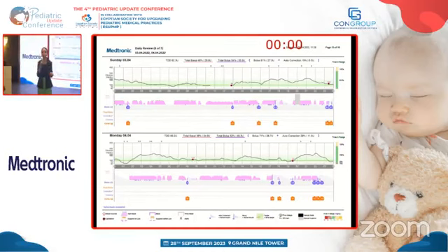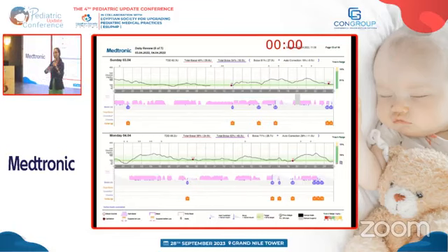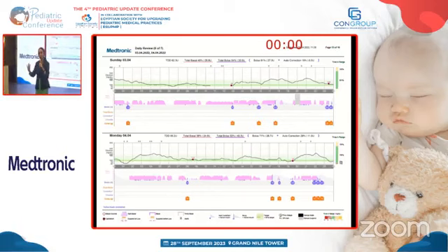هو مش محتاج يعمل حاجه كتير، انا السيستم محتاج ان البيشنت يتدخل بشكل اقل. بالعكس انا مش عايز اتدخل كتير، مش عايز افكر، انا عايز السيستم بس ان هو يكيب التكنولوجي هي اللي تليد، يسيب الالجوريزم هو اللي يشتغل. ده هيوصلنا في الاخر للبيست كنترول اللي احنا كلنا وي وونت تو اتشيف.